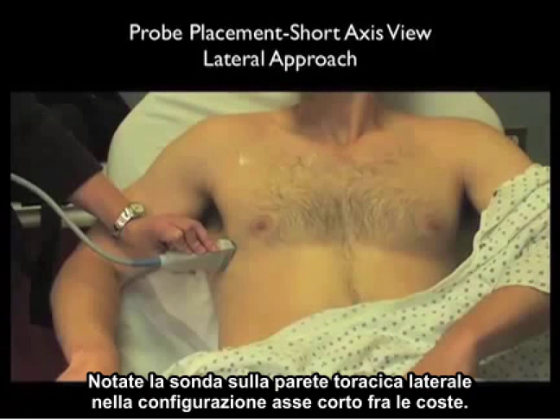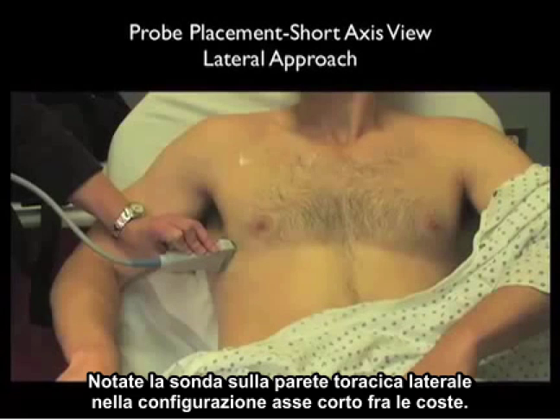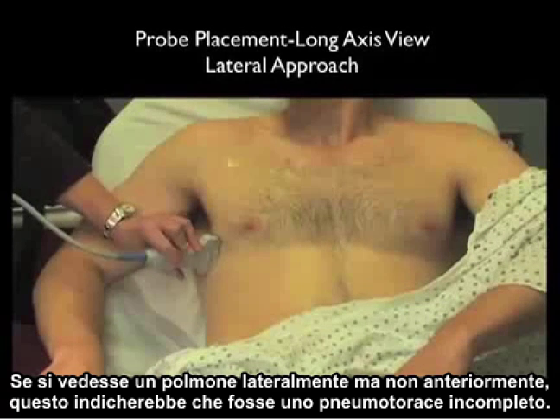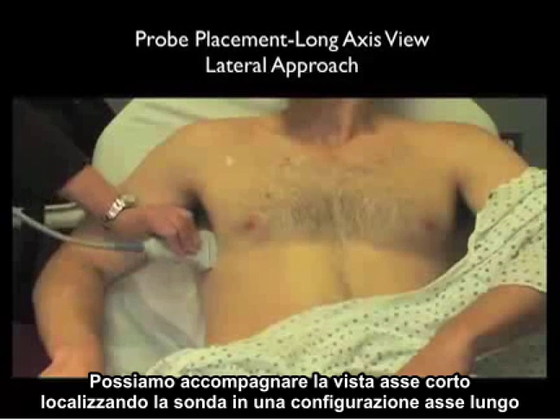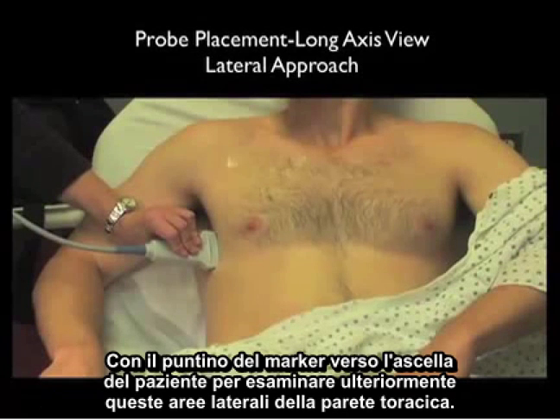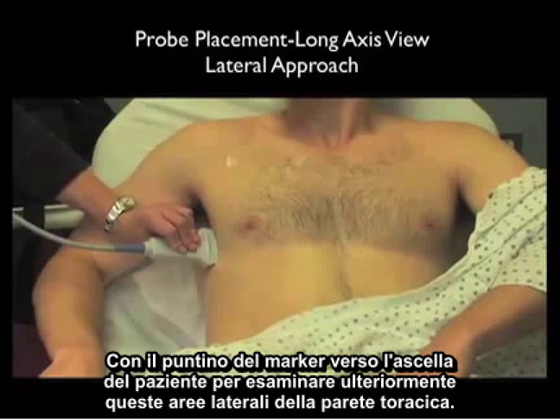Notice the probe on the lateral chest wall in the short axis configuration between the ribs. If lung is seen here laterally but not anteriorly, this would tell you it was an incomplete pneumothorax. We can complement the short axis view by locating the probe into the long axis configuration with the marker dot towards the patient's axilla, to further examine these lateral areas of the chest wall.